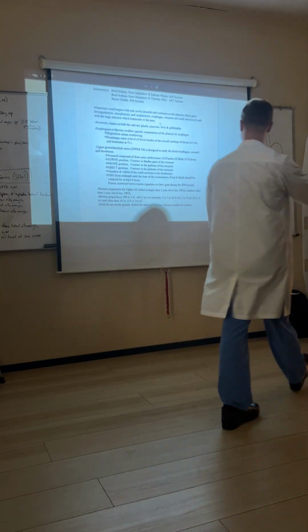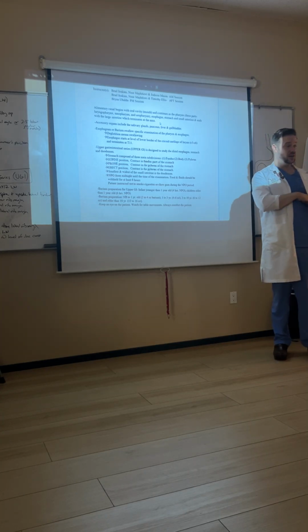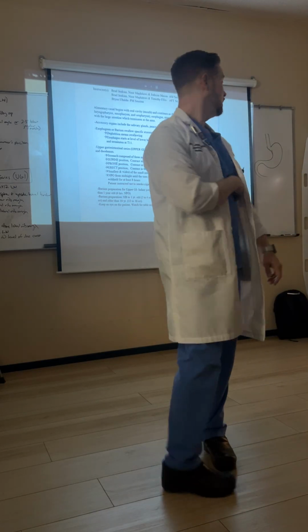The fundus is the uppermost part of the stomach, balloon-shaped portion here. It's where you see that gastric bubble sitting right under the left diaphragm on an upright abdomen or a chest x-ray, okay?